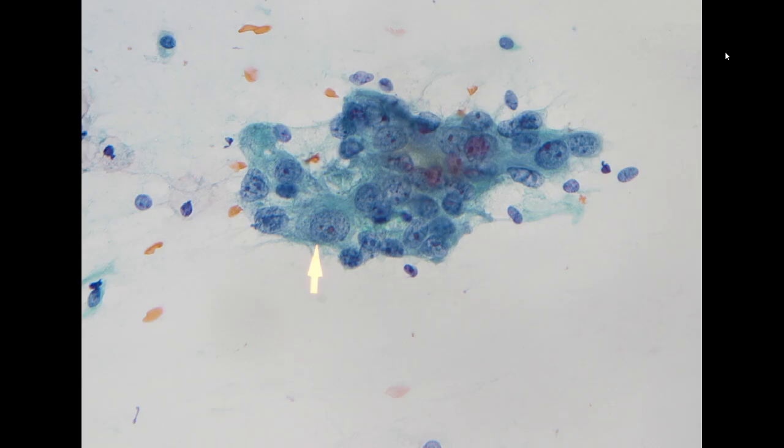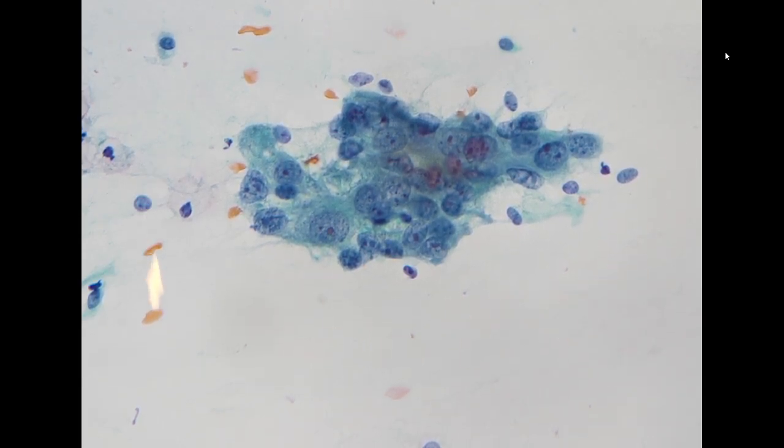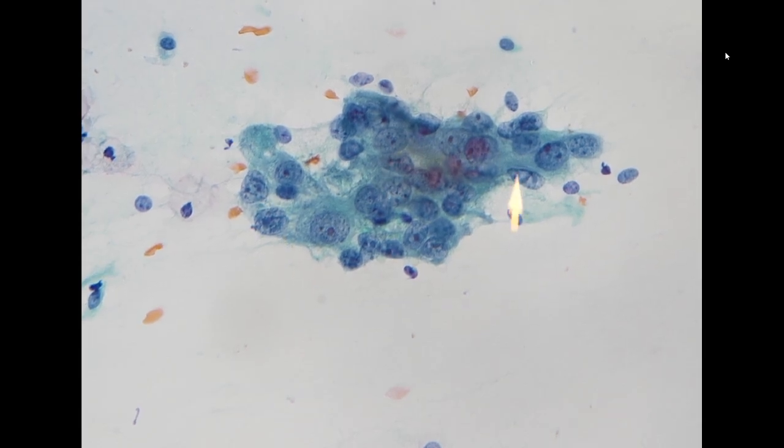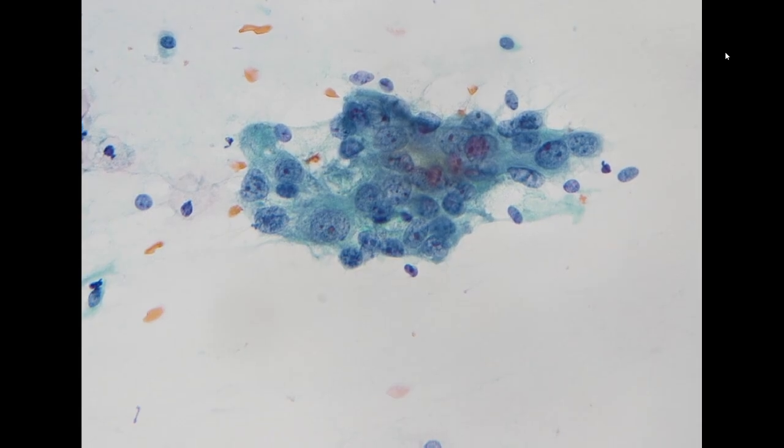So I think this cluster is kind of difficult. You would debate whether to see these as just repair cells and call it negative, or whether we should call these AGC. Basically the differential for this cluster is negative versus AGC. You do see they are glandular, with a rosette-forming pattern, and the cells show some nuclear polymorphism, but nuclear polymorphism is also very common in repair.